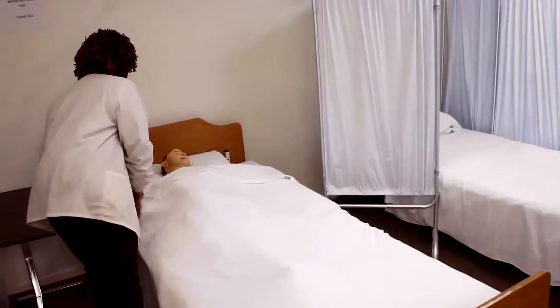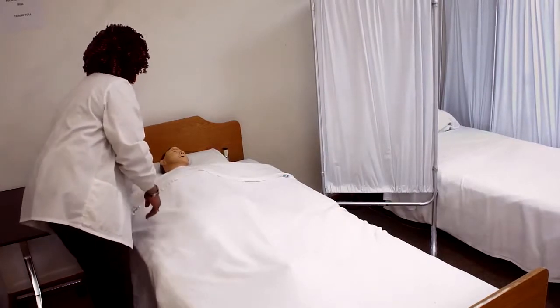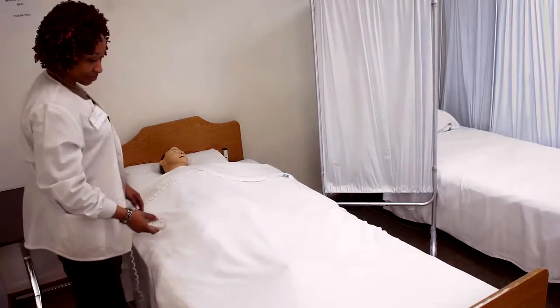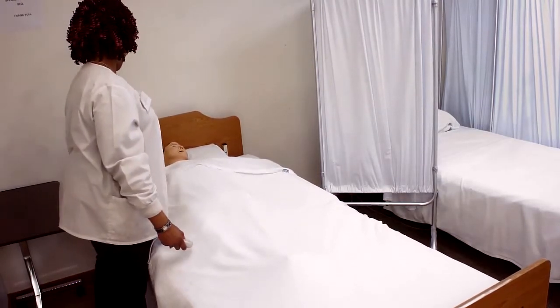Good morning, Mrs. Johnson. I'm Nicole. I'm going to be your caregiver today. I'm just going to clean your catheter up. Is that okay with you? Okay, great. I'm going to go ahead and raise your bed up to waist level so I can protect my back. How's everything going for you this morning?